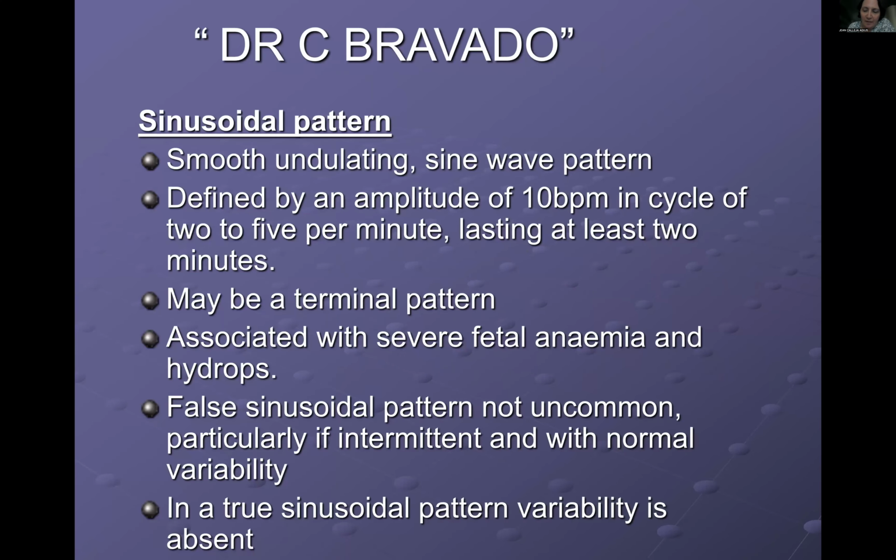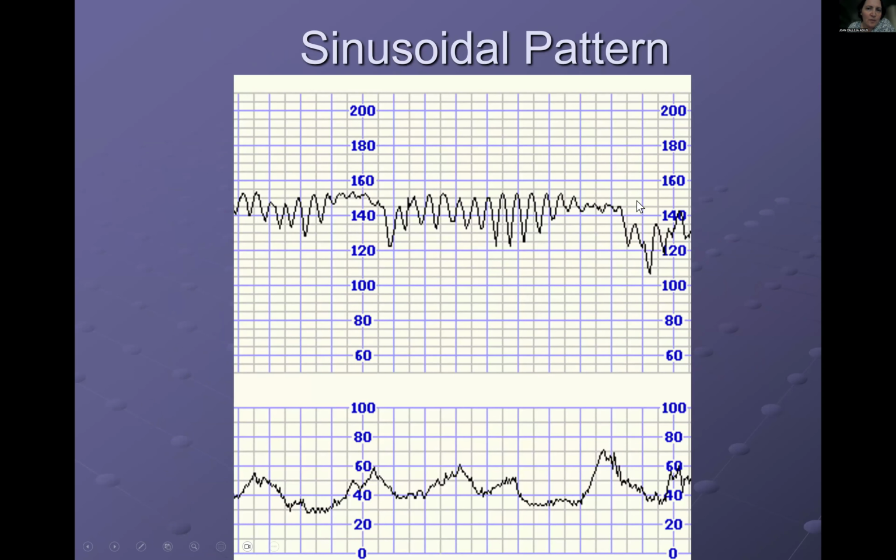All right, then there are some wave patterns which are definitely ominous. And hopefully you don't get to see that. Luckily they are not that common. That is the sinusoidal pattern. I'll show you what I mean by sinusoidal pattern. So this would be a sinusoidal pattern.